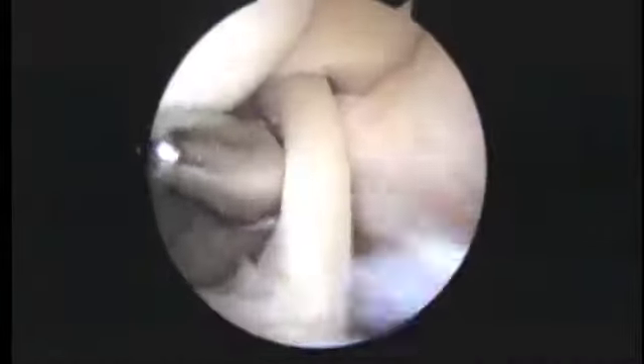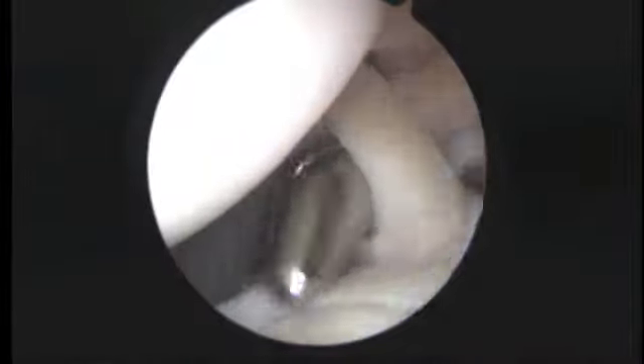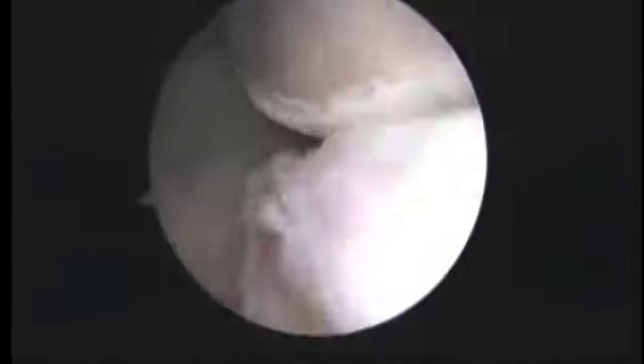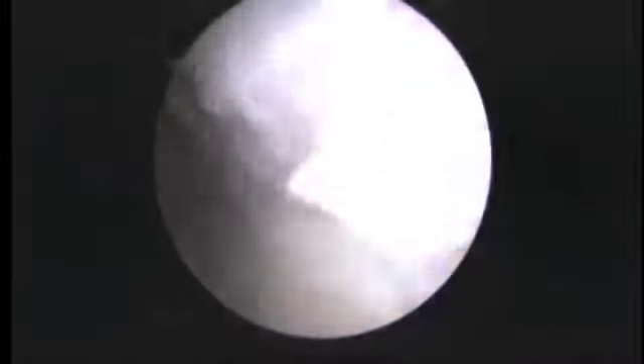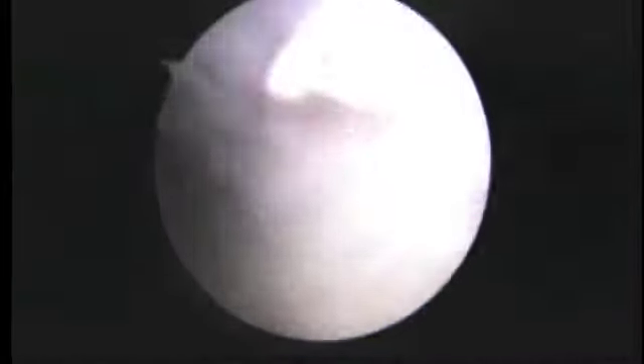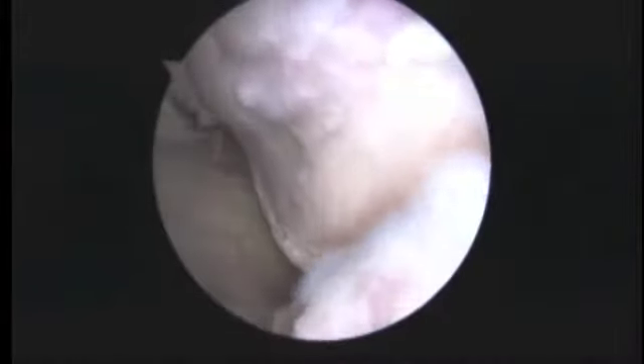As we look up at the rotator cuff, the tendon looks okay — that's a good sign. Then we rotate to the back and we can see a Hill-Sax lesion, actually a pretty good-sized one here. I haven't decided yet if we have to do anything to address that or not; it's something we sometimes have to put an anchor in as well.